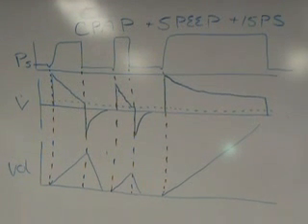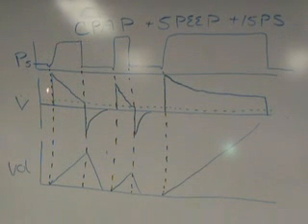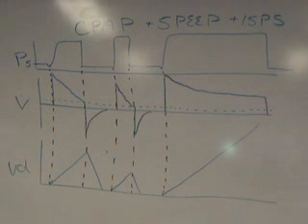So if you were to classify pressure support, you would say it is patient triggered, pressure limited, flow cycled ventilation with a backup time limit. In layman's terms, whenever the patient triggers, the breath is given a pressure boost, which gives me a little bit more volume compared to if my patient was just breathing spontaneously at an elevated baseline, such as I would see with simply CPAP with +5 of pressure or of PEEP.